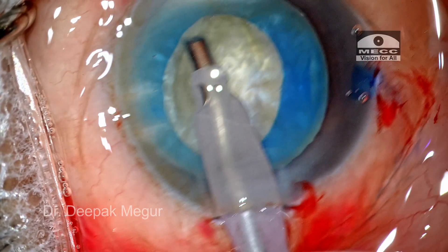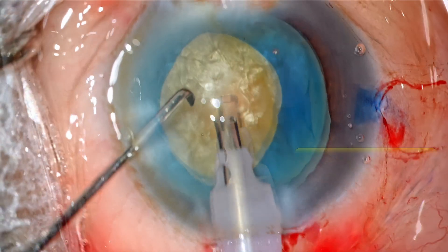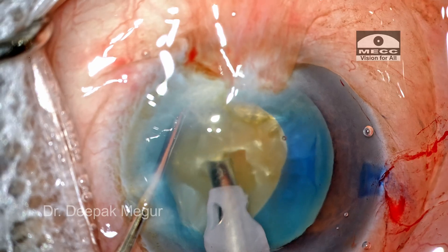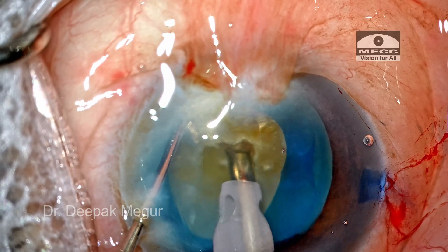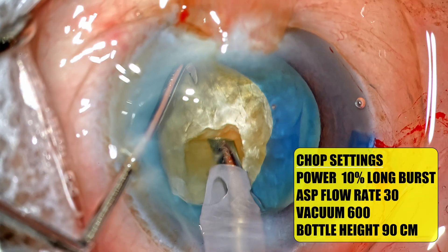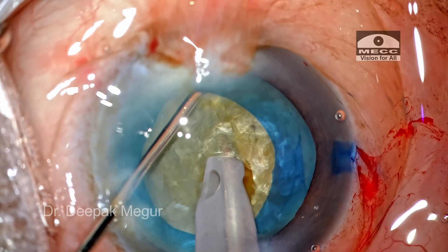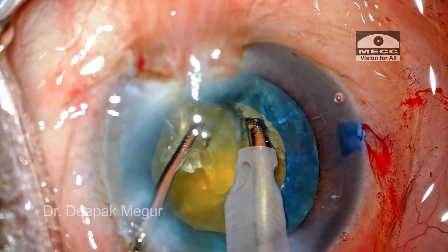Time to perform the phacoemulsification. The nucleus appears to be slightly denser. The superficial epinucleus and cortex is aspirated out. The nucleus is stabilized with the second instrument and I'm going to create a small trench in the central part of the nucleus. The reason I create this trench is to ensure I get a firm hold on the core of the nucleus so that there is no torque while trying to divide this dense nucleus. I'm aiming to about 40% depth, with the bevel turned to the right side, and the tip is buried into the substance of the nucleus — I want to ensure that the entire length of the tip is buried.